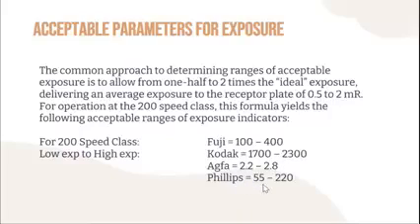And then for Philips, I have not discussed this one last time. But what is the median value for Philips? Since the range is from 55 to 220, that means the median pixel value is what? Okay? It is 110. Okay? So when you multiply by 2, it's 2 times the ideal exposure, since it goes from low exposure to high exposure. So 220 is high exposure, it is an overexposed value. 55 is underexposed, with the appearance of quantum mottle.